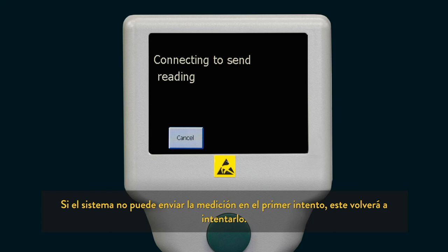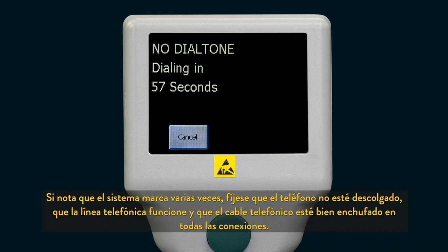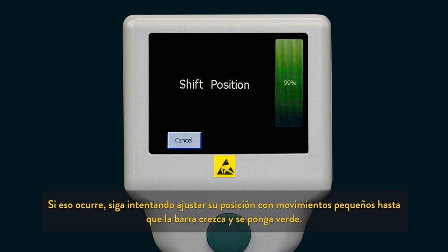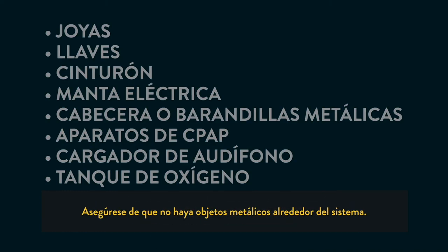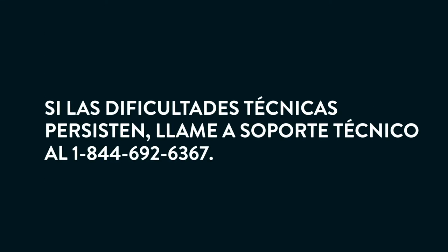If the system was unable to send the reading on the first try, it will attempt to send the reading again. If the system redials multiple times, check to ensure no phone is off the hook, the telephone line is operational, and telephone cable connections are secure. If the system is having trouble getting a good signal from the sensor, the signal strength bar may go between green, white, and yellow. If this happens, continue to reposition yourself with small movements until the signal strength bar rises and turns green. If the signal strength bar is blue, this indicates your system is picking up interference from something other than your sensor. Ensure the area around your system is free of metal objects. If you experience other technical difficulties, please contact technical support at 1-844-692-6367.